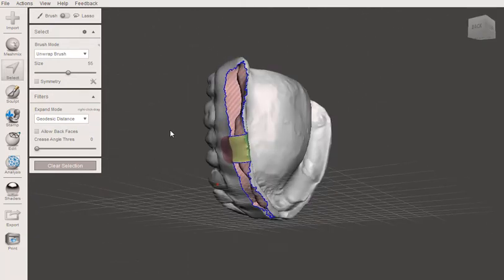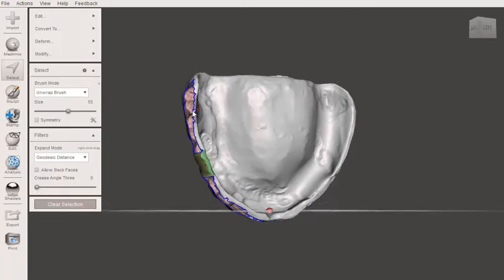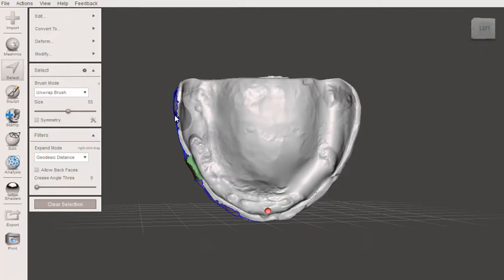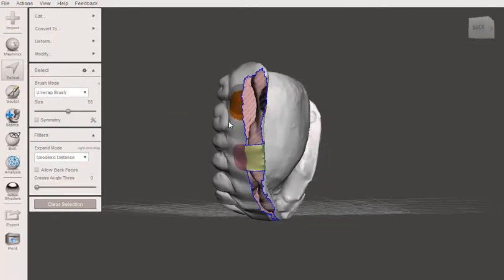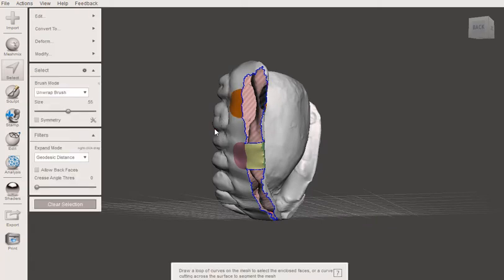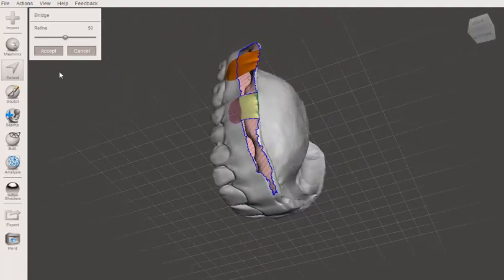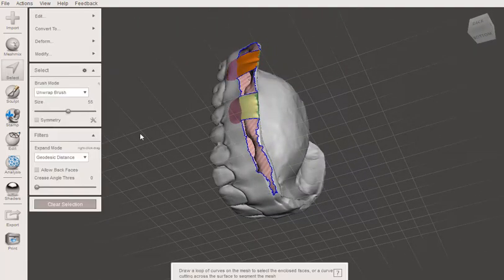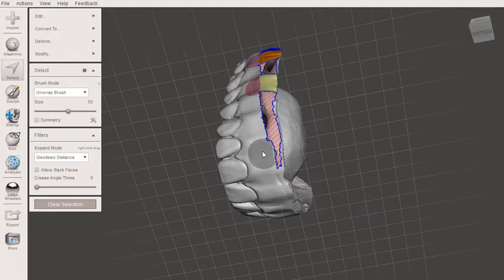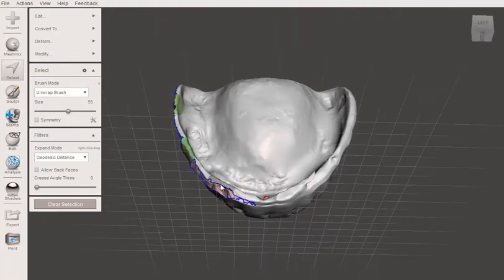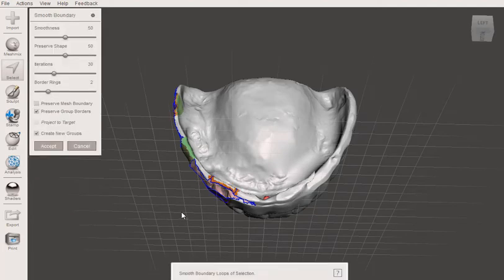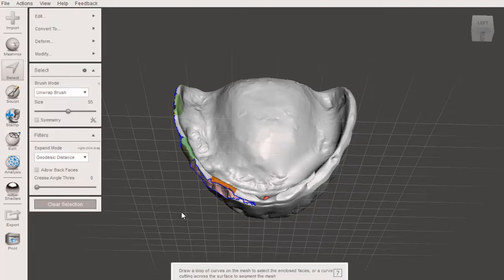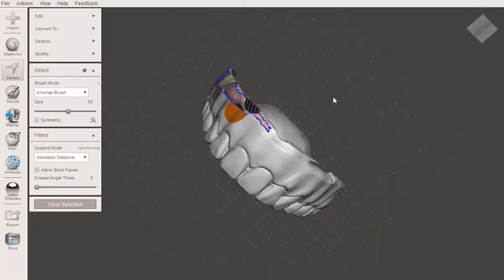So I'm going to do that again. Control B, bridge. Looks good. I won't need to do the soft transform. B, enter, control B.